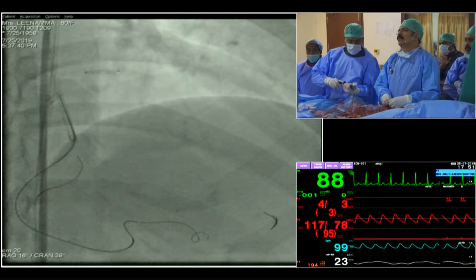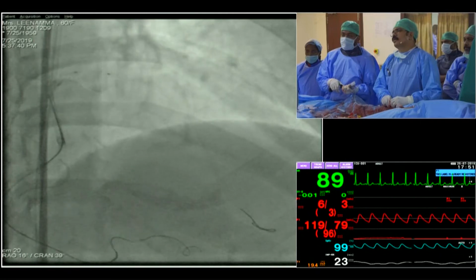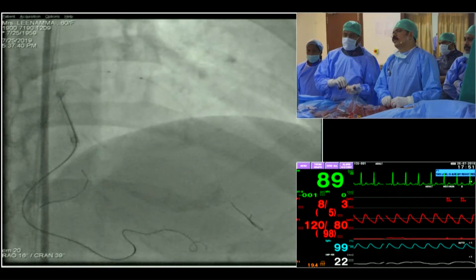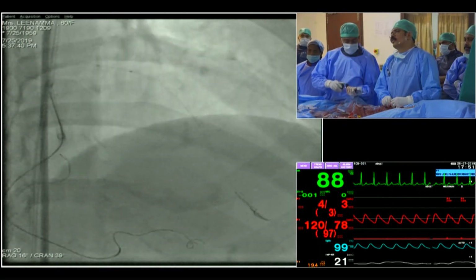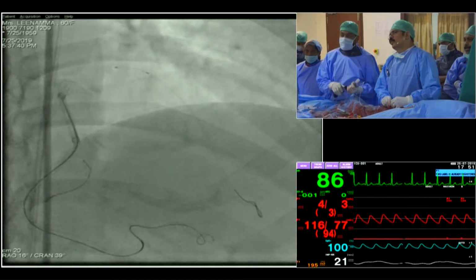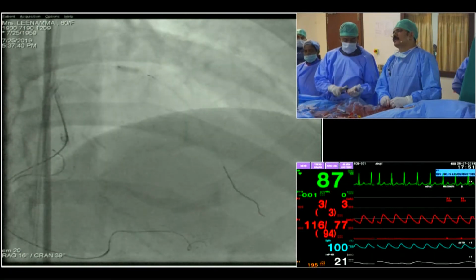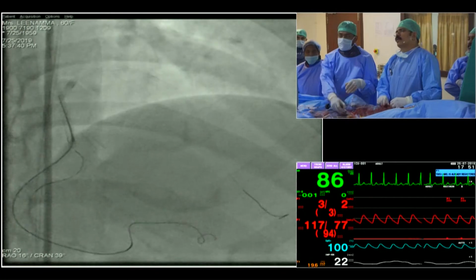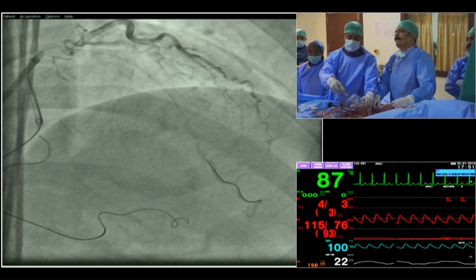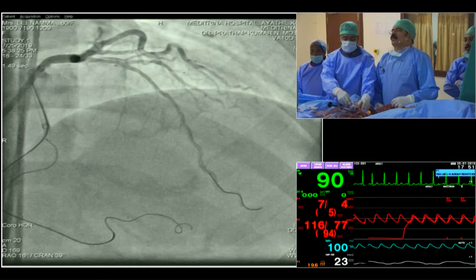Deflate. I have to say that this kind of situation is really hard to anticipate, but it can happen that after the first attempt of antegrade approach, after this dissection, you can have a process of positive remodeling. So in that case, the artery gets bigger, so the second attempt of rewiring antegradely can actually be more facilitated, I would say. I will not say easier, of course, but definitely you have a higher chance. This is why the second attempt is always better than the first, because you know what you have to do, and the job done before can be helpful, despite it wasn't actually a failure.